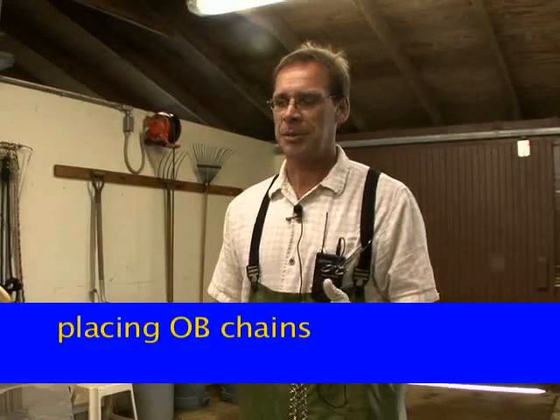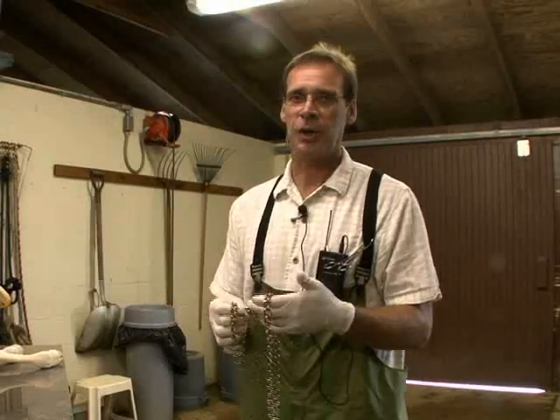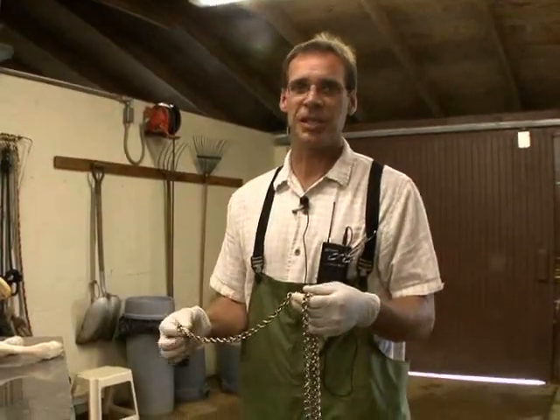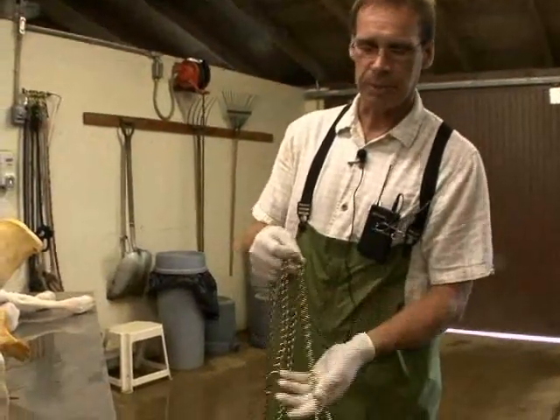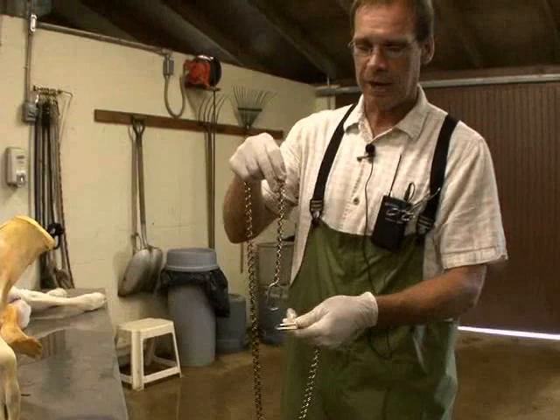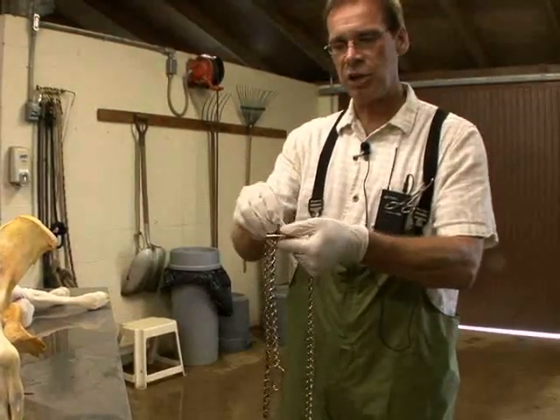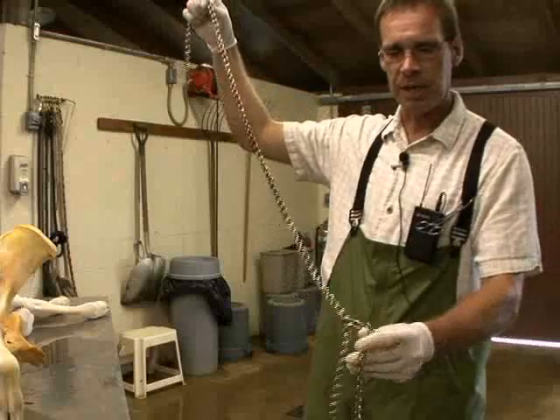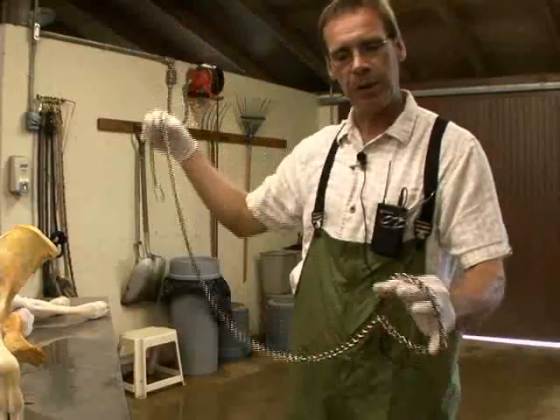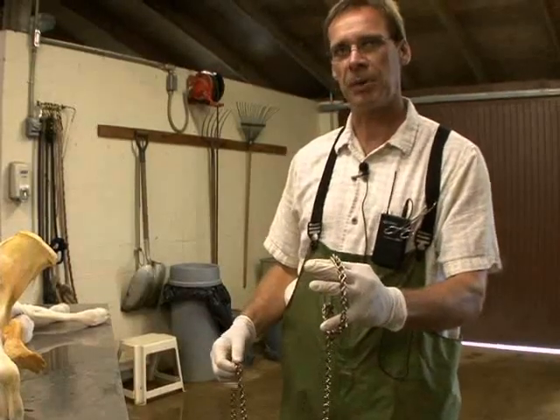Today I'm going to demonstrate placing OB chains on the legs of the calf in order to assist in delivery of the calf from the cow. This is an OB chain that we use. To correctly place the OB chain, you have to first create a loop by sliding one end of the OB chain through the larger loop in the chain and bringing it down into a small loop that you can easily place over the foot of the calf and into the proper location.